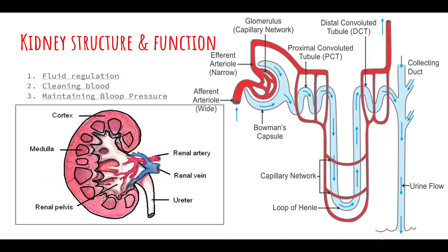So before we go any further, I'm going to talk a little bit about the kidney and its function, because the whole point of the CRRT is replacing the function of our kidneys, okay? CRRT stands for continuous renal replacement therapy. So it's basically replacing the function of our kidneys in case our kidneys do not function as they should, because of many reasons.